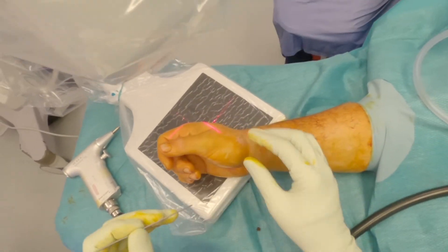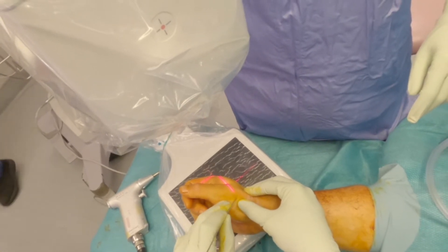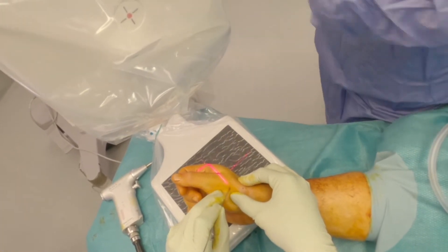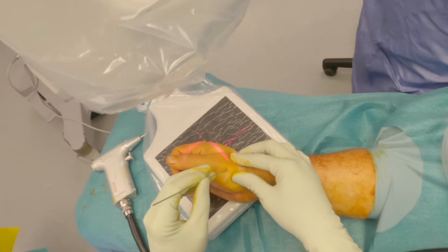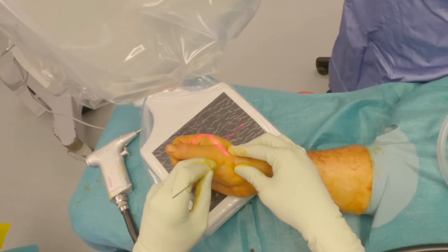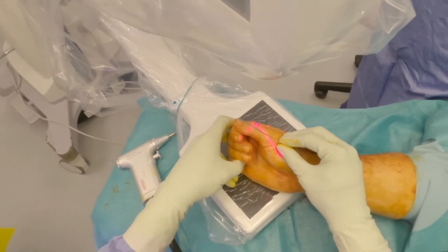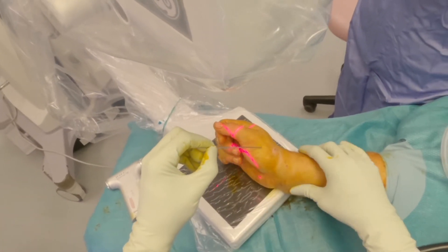A 1.6 mm K-wire is inserted through the skin at the glabrous border of the thumb metacarpal, just proximal to its midpoint. This entry point is selected so as to minimize injury to extensor tendons and sensory nerve branches, and to contact the bone near the base of the metacarpal where it flares outwards.